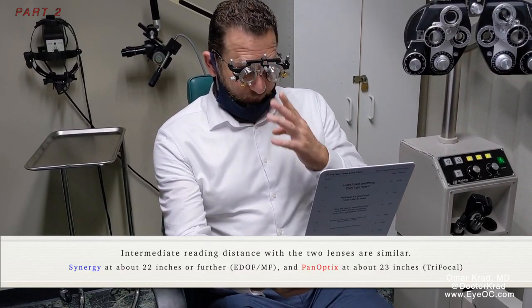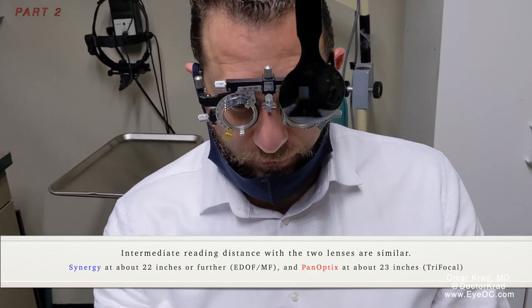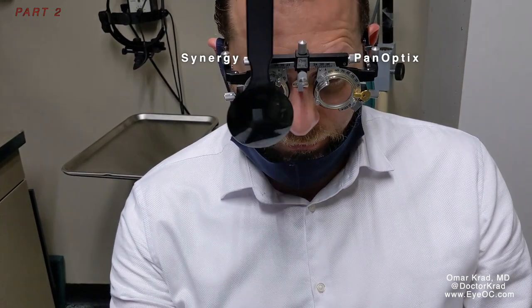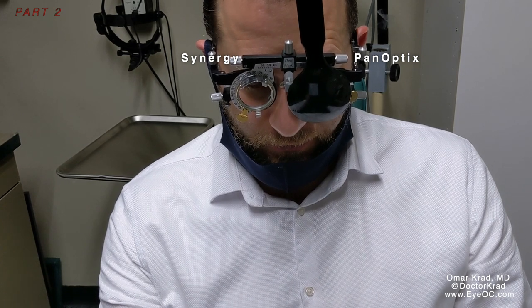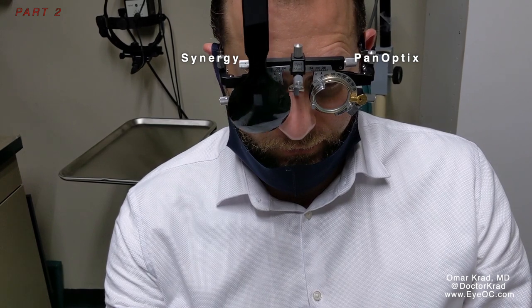Now we're going to try computer distance. This is at about 22 inches away — computer simulated distance. Here is the Synergy right eye, or do you like the left eye Panoptix? I think the left one is slightly better. So the left one — Panoptix — is slightly better.